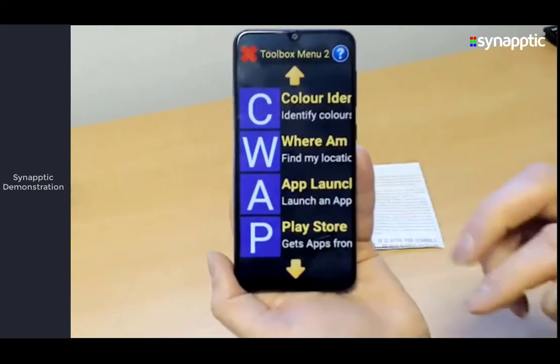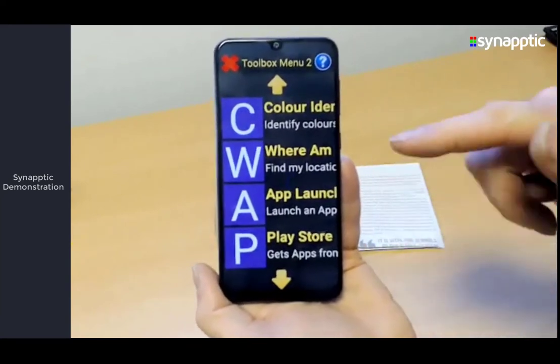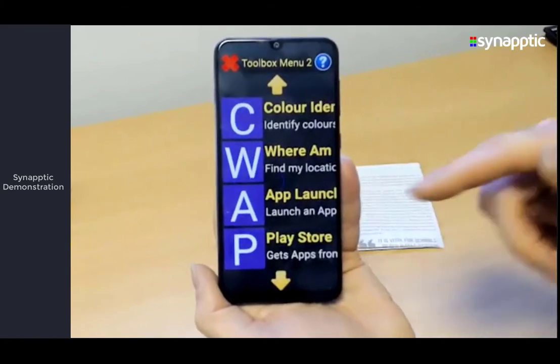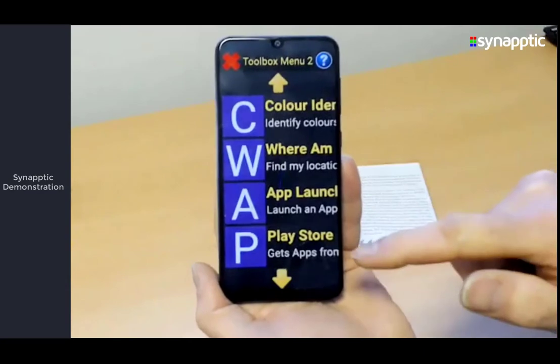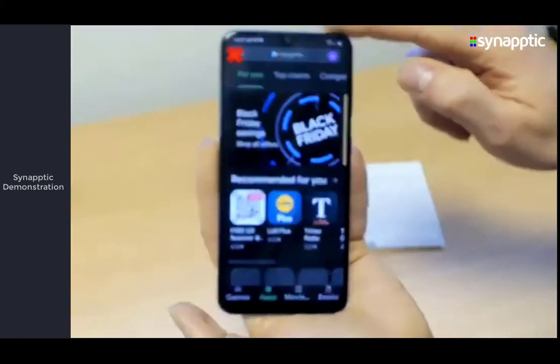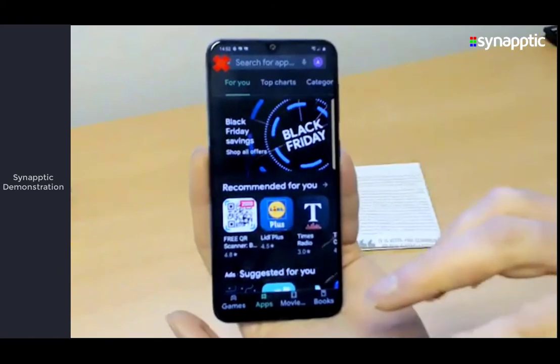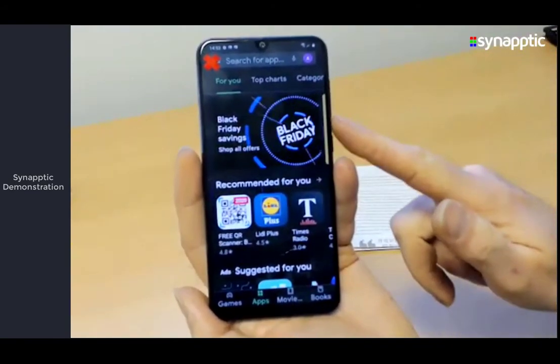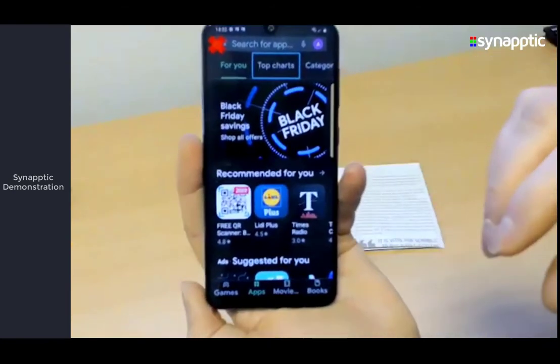Next we'll look at the app launcher and the Play Store. The app launcher shows all the apps on the phone and lets you pick one and run it. The Play Store option allows you to install extra apps. As soon as I run the Play Store, Synaptic Reader resumes — it's now going to read out anything on the app. The complication with apps is that their layouts vary — one app might have a search button at the top, another at the bottom, so you need a little bit of knowledge about the app's structure to navigate it well.